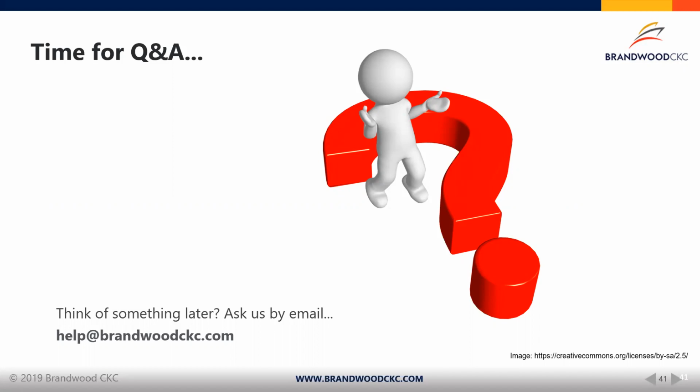And so what's absolutely fundamental is that as you collect data over time, you constantly reassess the current intended use of the device with this active learning. And if you evolve within the medical device category, then you'd be subject to the regulatory management framework. So as we mentioned before, as you collect data over time, you really need to constantly reassess what that means in terms of your regulatory processes, and whether or not you are getting into the land of medical device, or whether you're still essentially a tool to assist with booking or whatever the case might be.